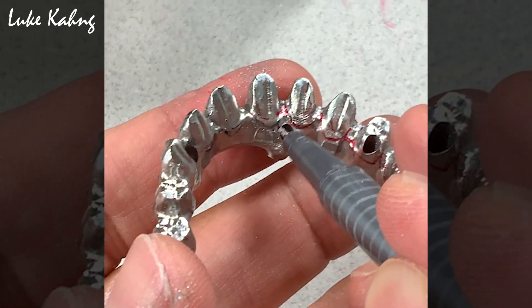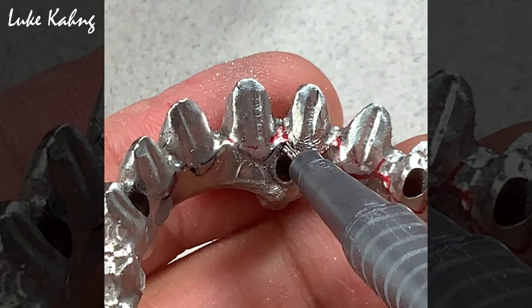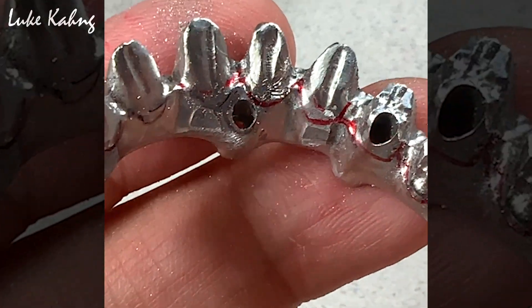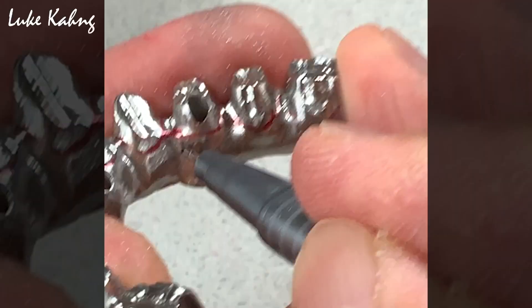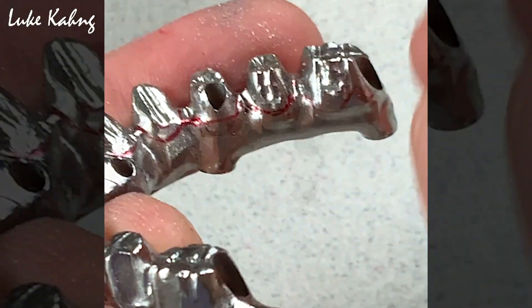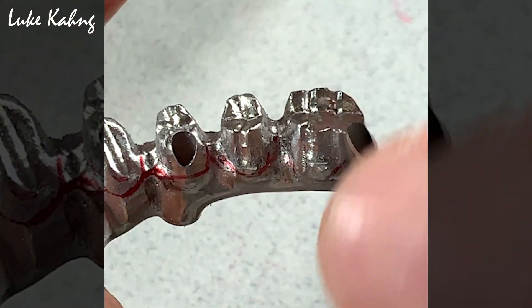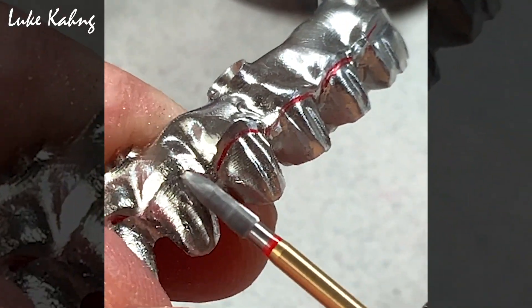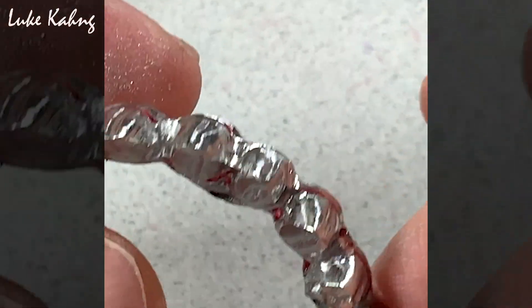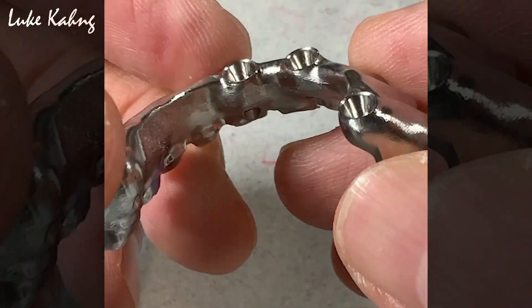So here we will be making the metal. So don't touch it here. Don't cover it. I will design like that. Same thing here. I want more nice all the way here. I'm okay going deeper so I get good retention. And so you can grind it like this — so you can make the top of that wax-up.